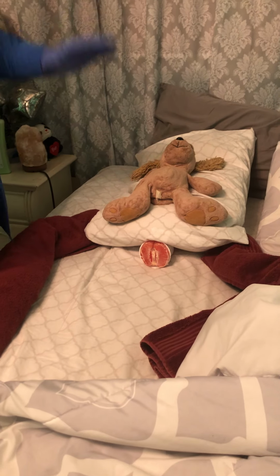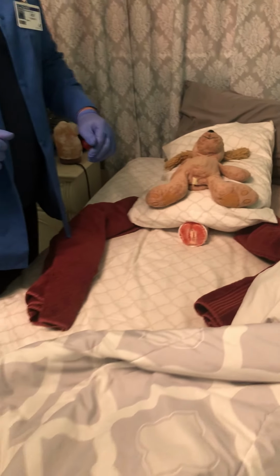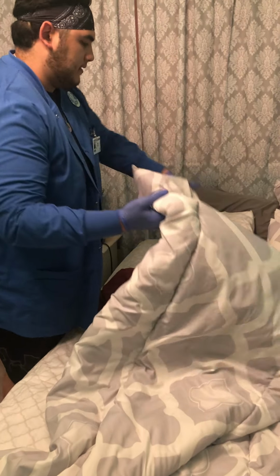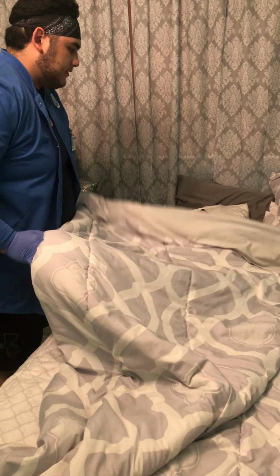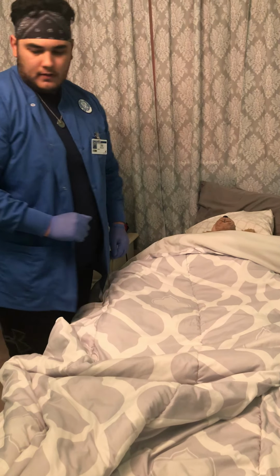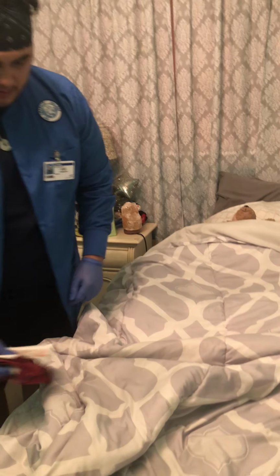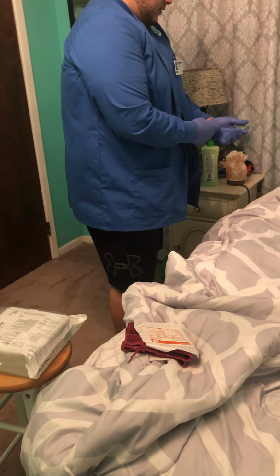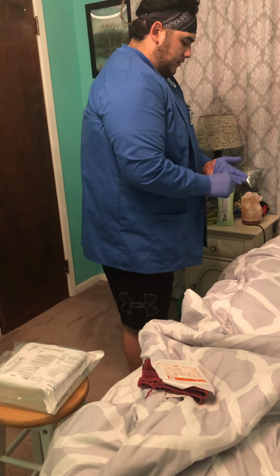Alright, so once we've cleaned the patient's peri area, we're going to go ahead and cover them up. You always want to keep your patient covered as much as possible while we go ahead and open our sterile catheter kit. And so we're going to change our gloves and perform hand hygiene.